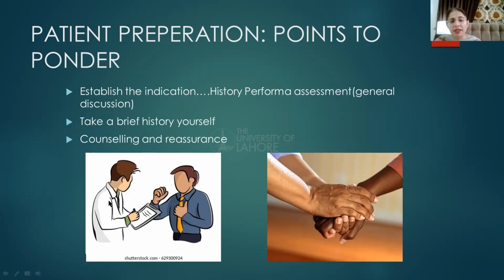And if possible, not in every case, if a brief history is taken by the technician himself, it's a good practice, because it can clear the ambiguity in your mind before doing the study. At the same time, it develops a bond of trust between the patient and the technician. And then lastly, counseling and reassurance, very significant, because it is important to explain the procedure to the patient before, during, and after the study. All the questions of the patient should be answered patiently, because as the patient is less apprehensive, he will be more attentive to your instructions during the study, and the result will be a better study for the reporting radiologist.